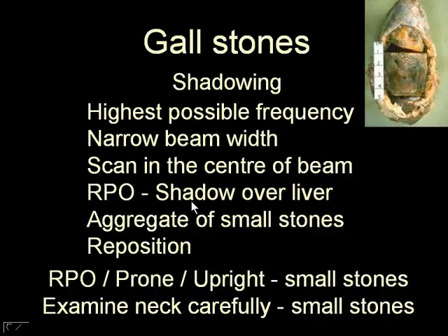Remember, just below the gallstone is pyloroduodenal gas. Pyloroduodenal gas gives rise to dirty echoes, isn't it? So if a shadow falls on these dirty echoes, a very faint shadow might not be picked up. But if I do an RPO and get the liver in the aftermath of the gallbladder, the shadow will get through the liver and I can see it much better.